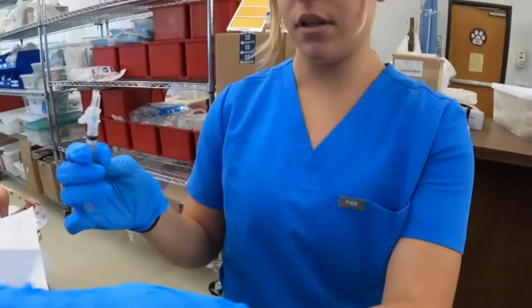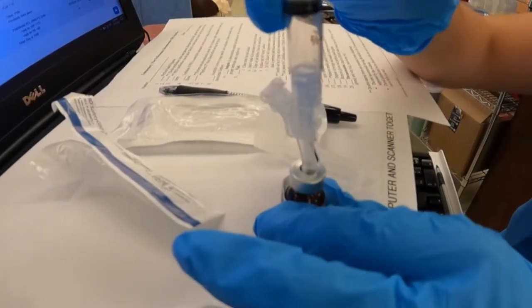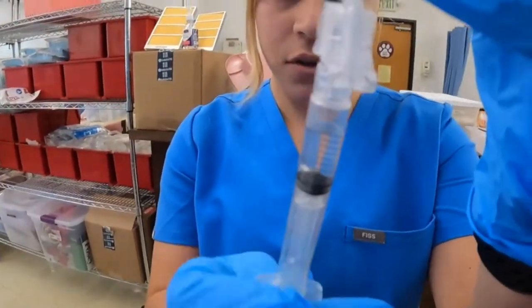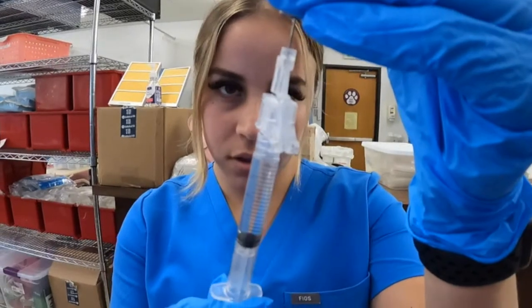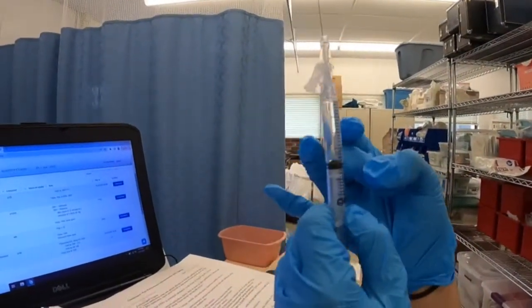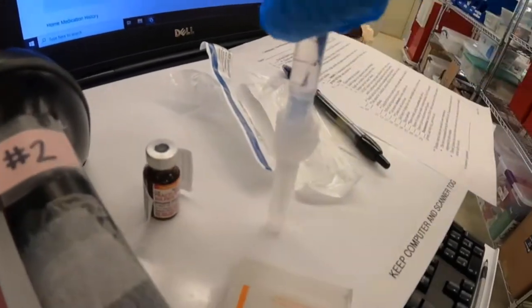We hold the syringe horizontal, draw up 2 mLs of air, and inject that into the vial. We turn it over and draw up 2 mLs of the medication. Be careful because it's the whole vial — we want to make sure the needle isn't pulling in air into the syringe. We have our dose, and we flick for any air bubbles. We have 2 mLs of morphine. Now we want to recap using the scoop method.